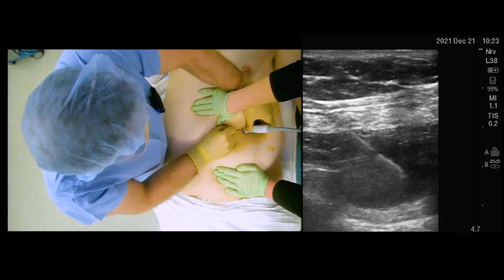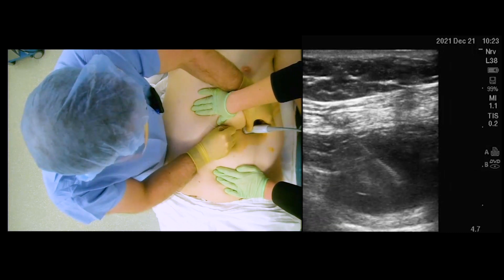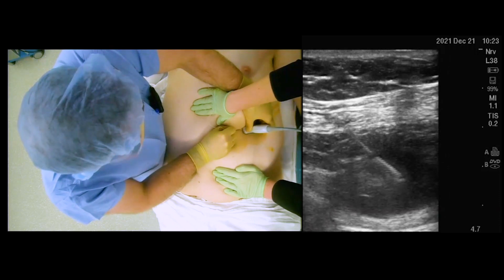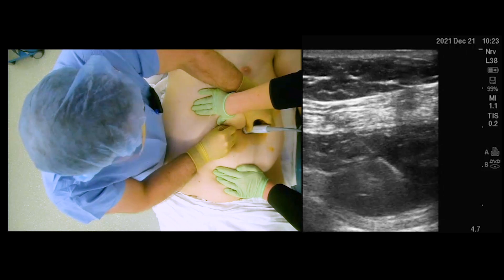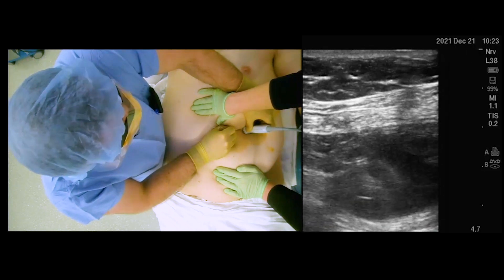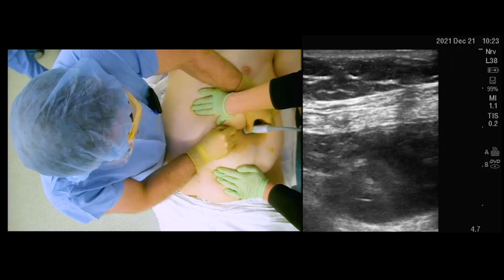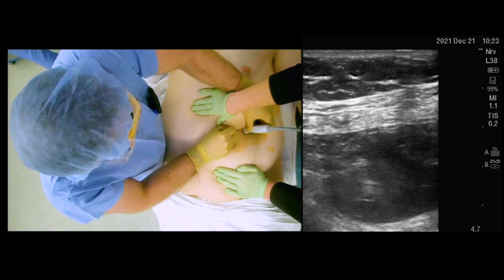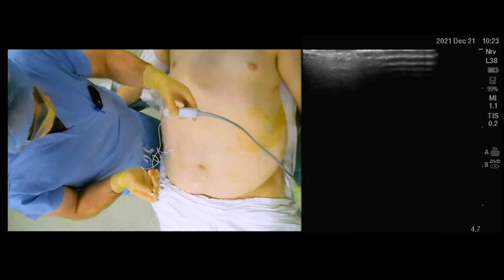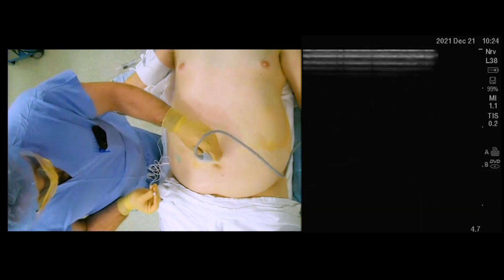The choice for this block was ease of placement. Additionally, quadratus lumborum blocks or erector spinae blocks could be performed. The benefit of this type of block is it can be done just a few minutes after induction of general anesthesia for patient comfort. Again, 20 milliliters of 0.25% bupivacaine with 2 milligrams of preservative-free decadron was administered.